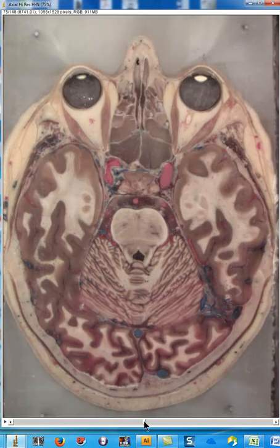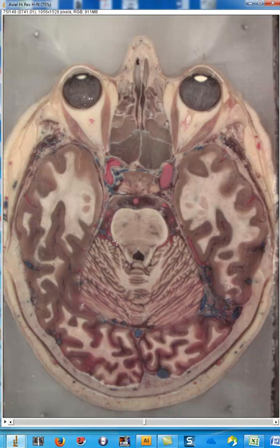Then we go down into the pons, and as a chest radiologist I can say that the only way I could tell that the corticospinal tracts are going through here is by magic.